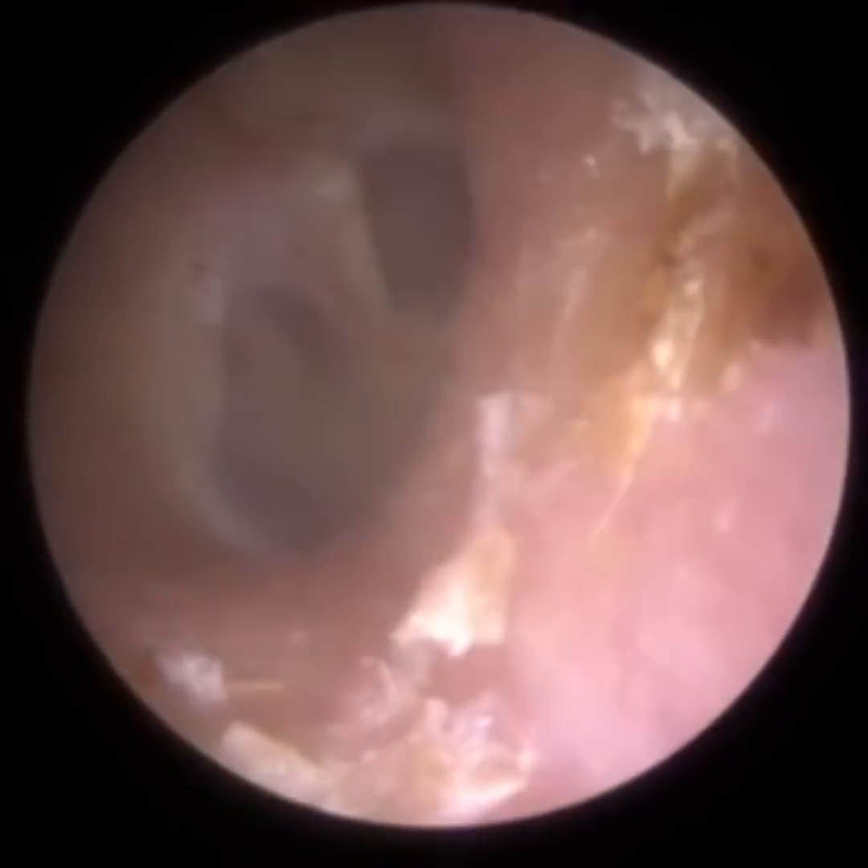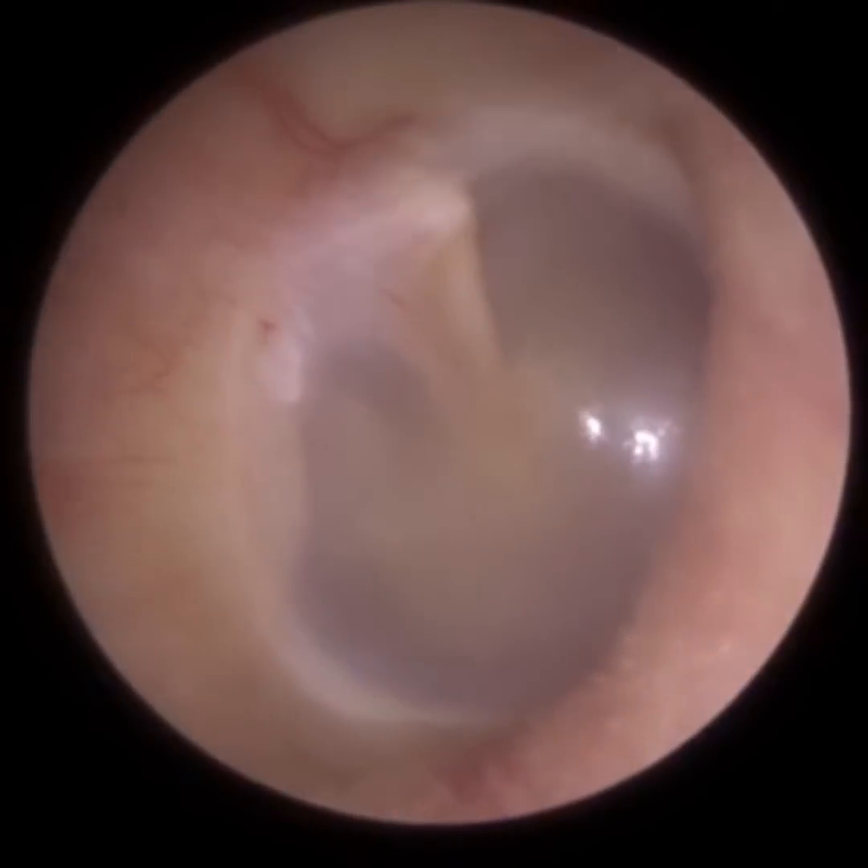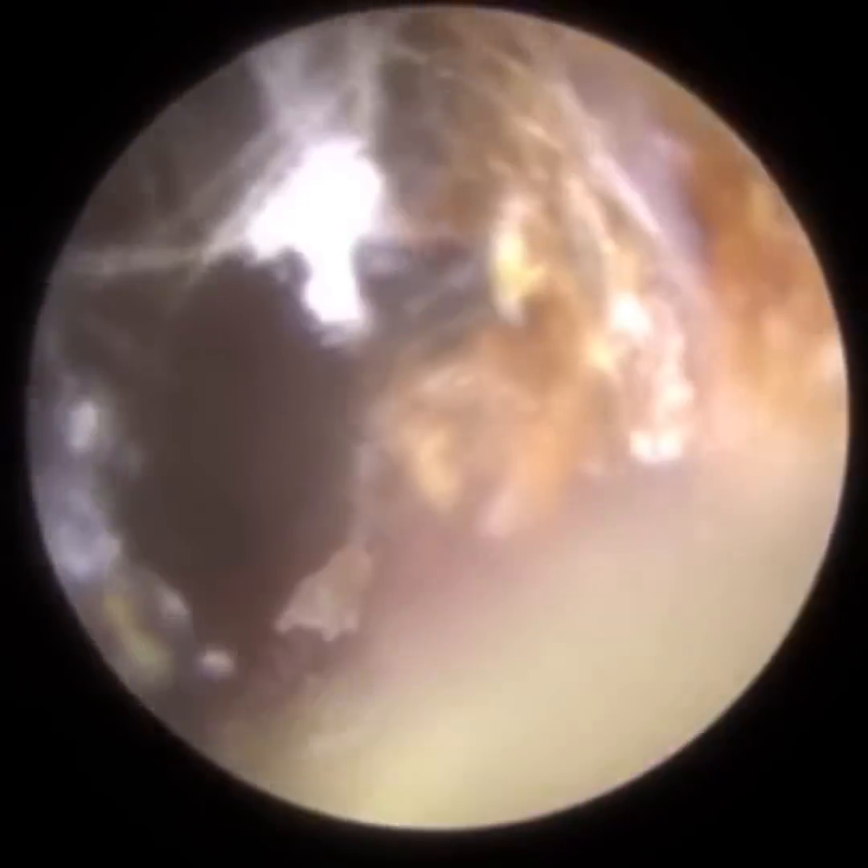In the left ear in particular — this is the same patient but this is the right ear — you can see there's no mastoid cavity there. I just used the Jobson horn and managed to remove all this wax laterally.